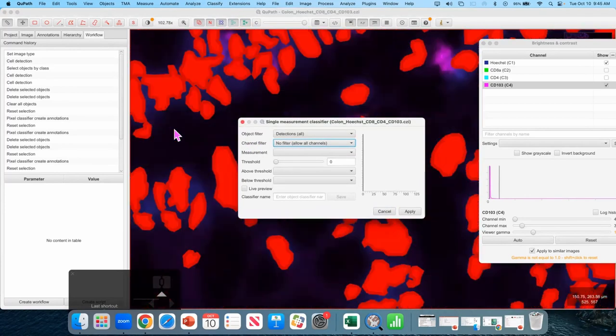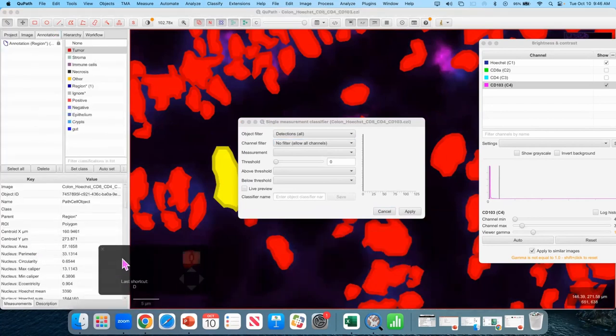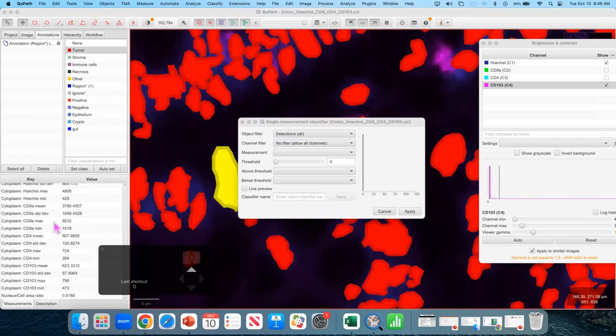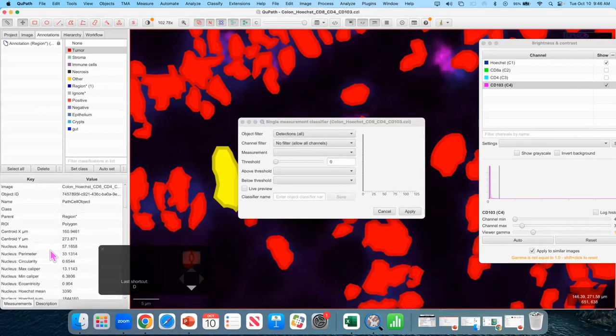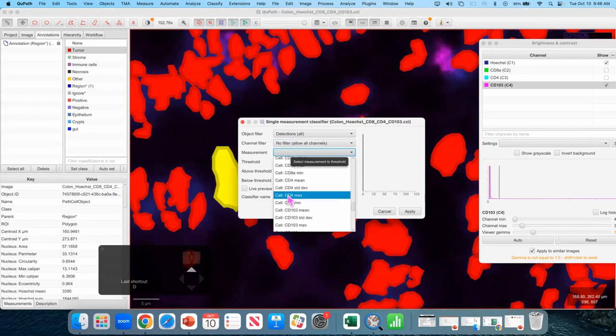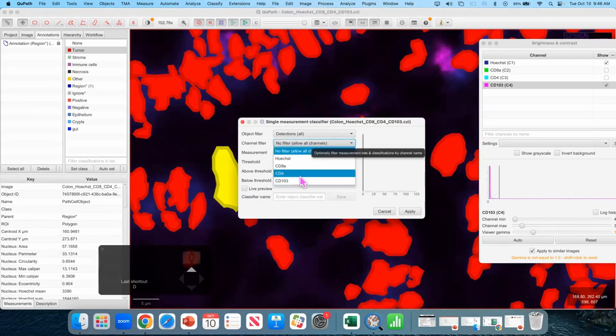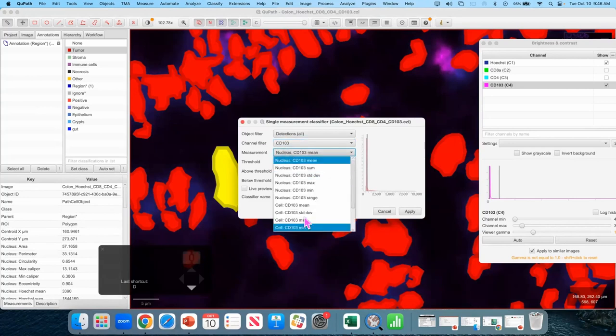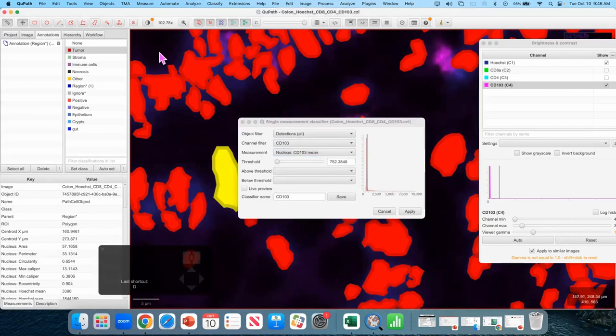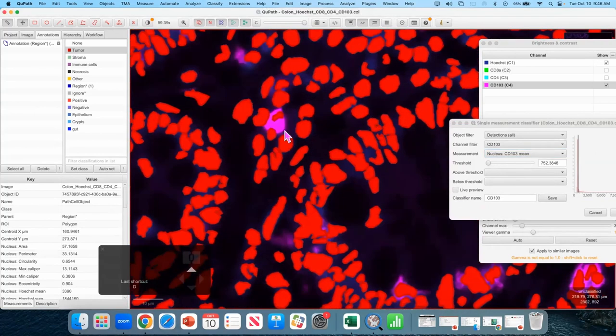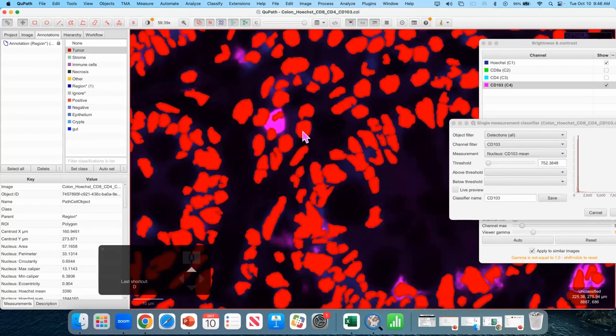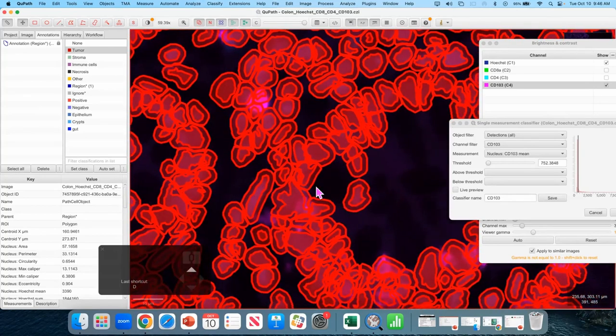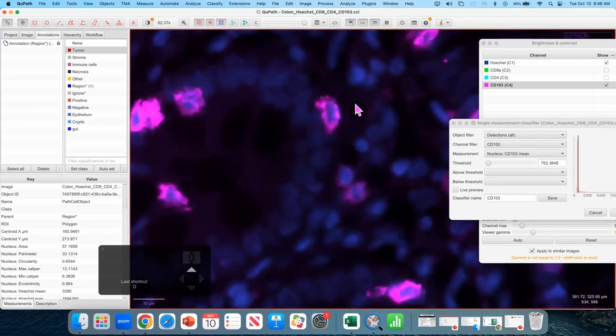So I'm going to there was a little confusion so I'm just going to go back. Classify object classification. Create single measurement classifier. At this stage if you can't see your detections make sure your detections are visible. And I recommend filling them in. Okay. So each of these cells has a large number of measurements, a bunch for every channel as well as shape and things like nucleus cell area. We can classify based on any one of them. So here here's that same list of everything that you can classify on. One way to make that list look a little simpler is to use this channel filter. And we want to classify based on the cd103 channel. And so this immediately simplifies to only the measurements that say cd103 in their names somewhere.